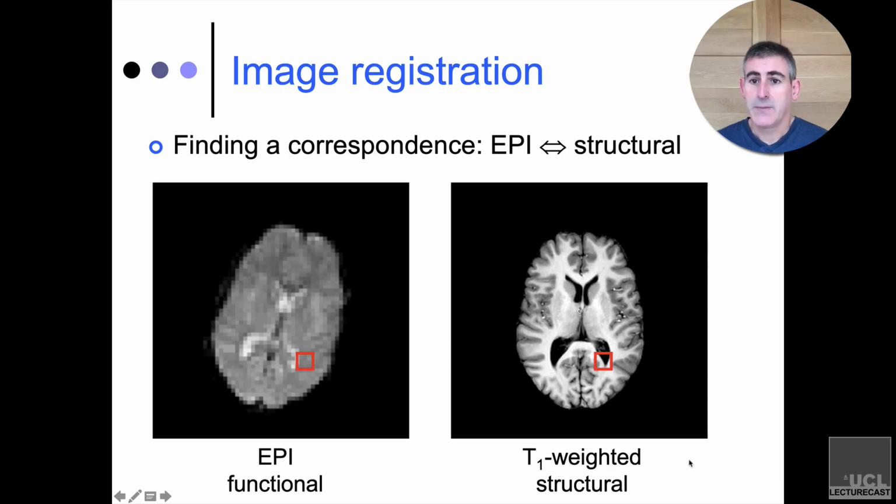It's fine. But that often means that, due to all of that little residual head movement we talked about previously, the heads aren't exactly in the same spot. Even though it's the same head, same person, same brain, it's not necessarily in exactly the same location when you acquire the 2 scans, which means that the images aren't in good register.